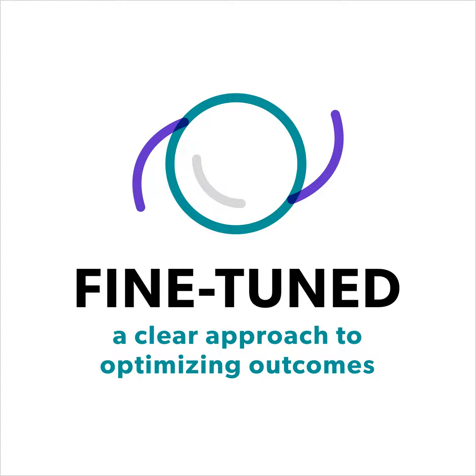You studied wavefront-guided versus wavefront-optimized with Dr. Joshua Rowe. Can you tell us about the three parameters where there was a difference between the platforms? Of course. Both platforms had excellent clinical outcomes. However, the wavefront-guided showed superior outcomes with regards to uncorrected distance visual acuity at the higher levels of visual acuity of 20/12.5 or better. The wavefront-guided also showed significantly greater gains in corrected distance visual acuity and demonstrated significantly better outcomes with regards to both 5 and 25% best corrected low contrast visual acuity.